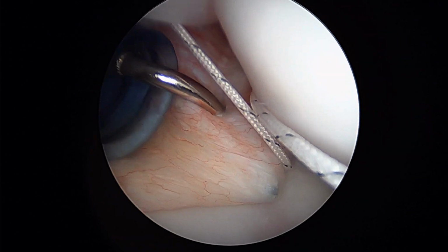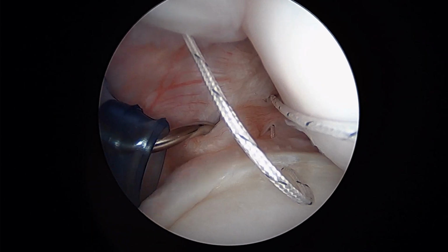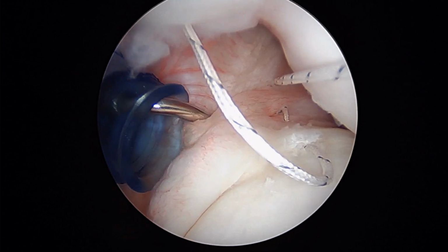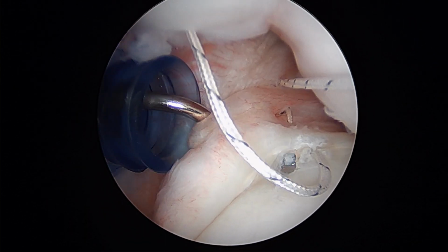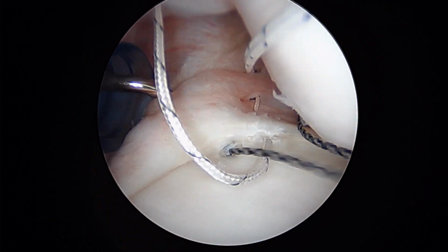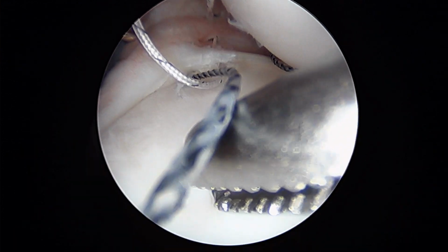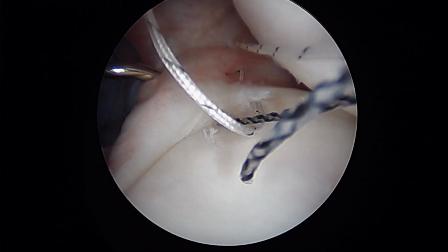Now you can see we're creating that pinch like that. And now we're going to go underneath the capsule right here a second time. Again, there it is coming out right there. Hold this right here. We'll go ahead and grab the relay here. We'll show you some more in just a minute.